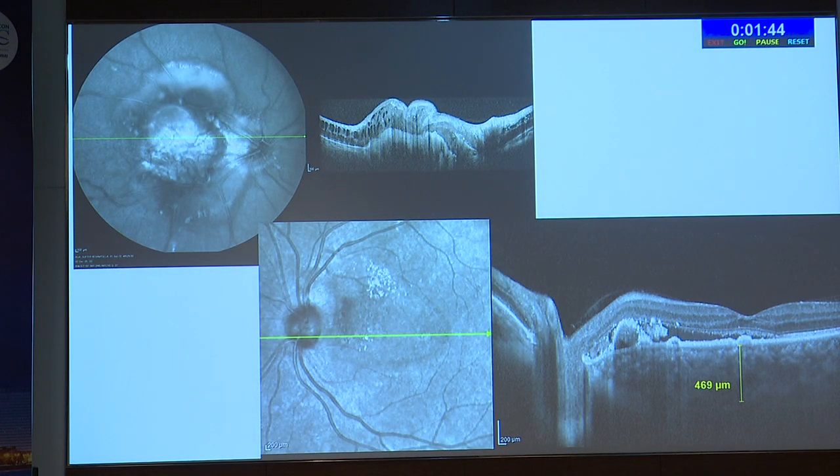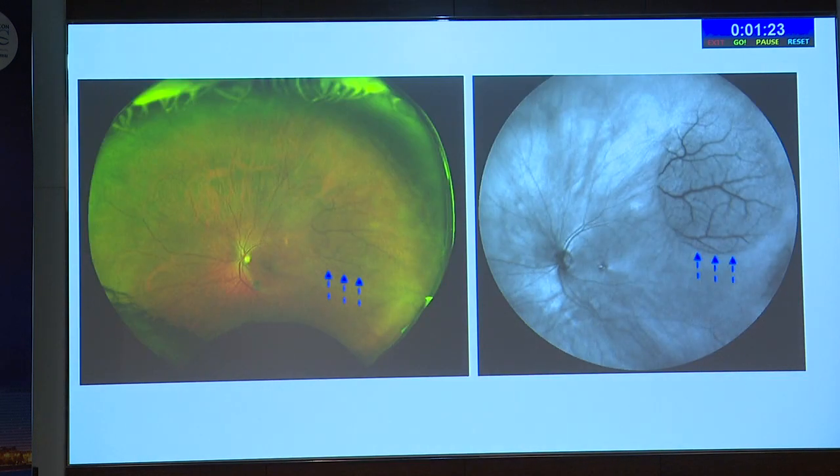Because of the excellent imaging, you can see the infrared imaging, not the red-free, infrared imaging. You can see the black and white picture of the fundus image, exactly where your scan is passing through, what area of the fundus is being imaged, seen excellently with this. So that is the true strength of the infrared imaging, which is very important.